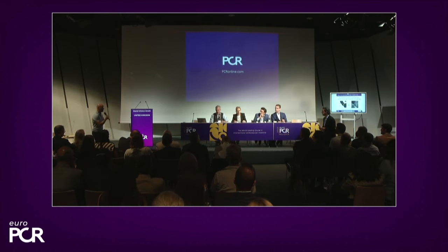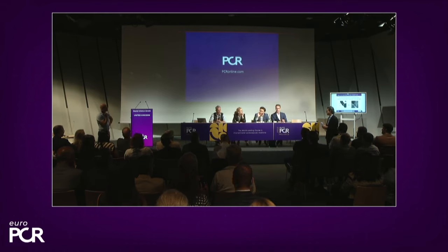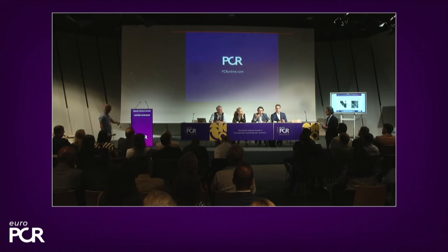Well, the concept is very important. Maggie, go ahead. One comment. Can you turn on my microphone, please? Thank you. I think this is a very relevant question, indeed. When we're doing our heart team meetings, we're going to treat patients that are younger and lower risk, right? We have to, number one, understand who our team is. What is the level of comfort of our surgeons, for example, to do root enlargement in a patient with a smaller annulus or a smaller root? Because we have to take this into account in the risk profile of the patient.